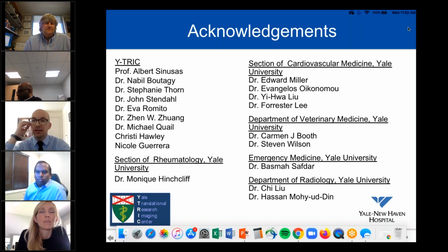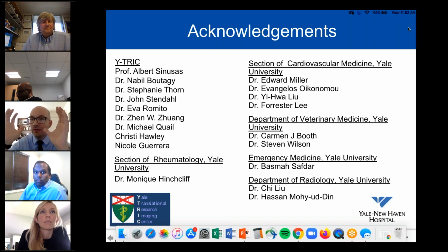So I think our data does not address this finding, but I think it would be reasonable to do yearly follow-ups with the PET coronary flow reserve. I think what could be changed, based on all the great data that has been published recently, is to switch the thinking that we have to do invasive assessment for these patients yearly, or even starting for the first 5 years.